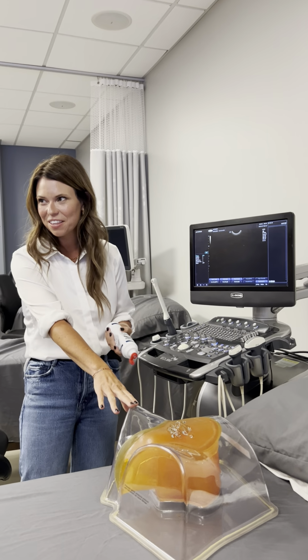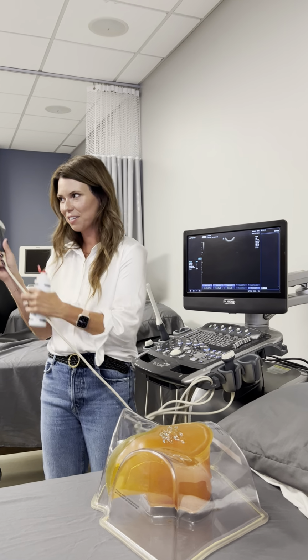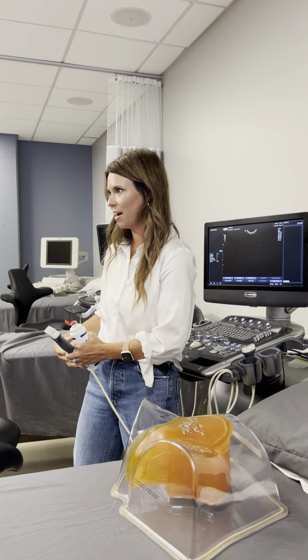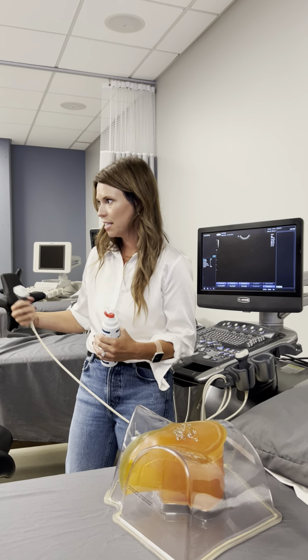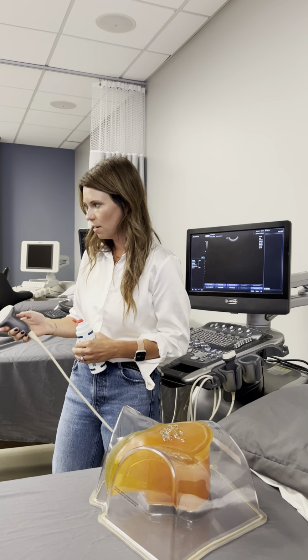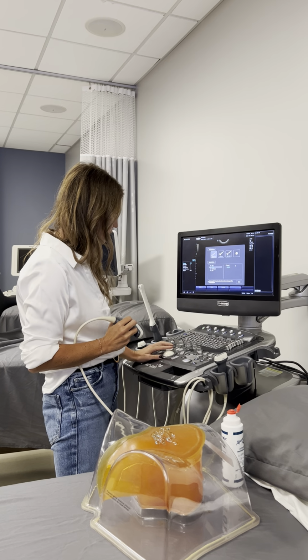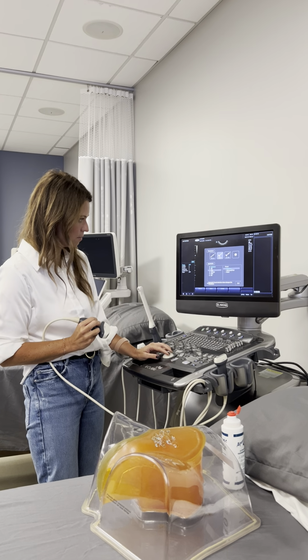Okay, so we're gonna start with our transabdominal approach. And this is the curved linear probe. Anytime we're using this probe, we're looking at a big area, like the abdomen. We use this for babies, for pelvic ultrasounds, and sometimes on really big legs. But this is gonna be our main big probe. So you'll go to transducer, hit my probe, and then go to GYN.